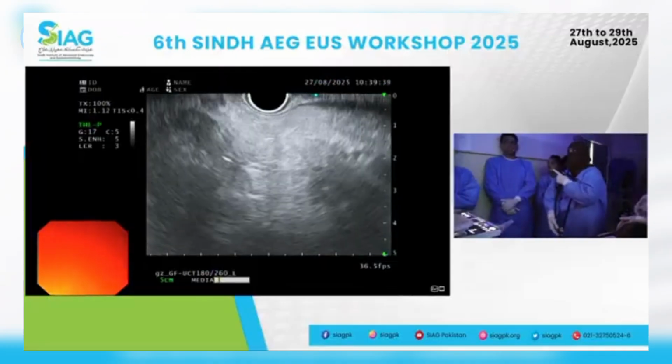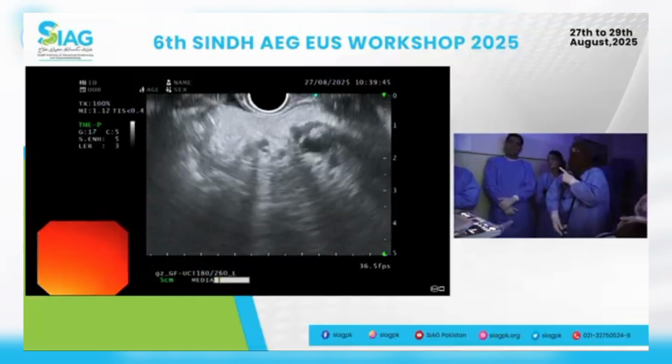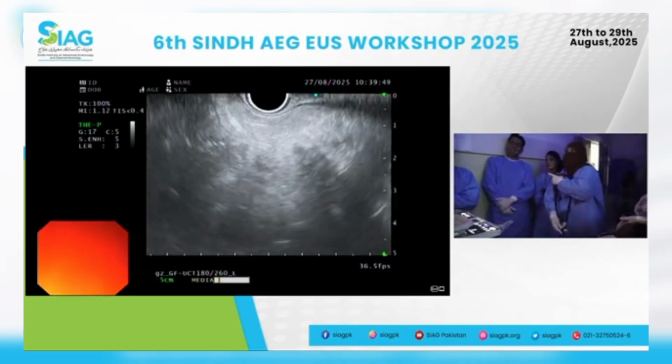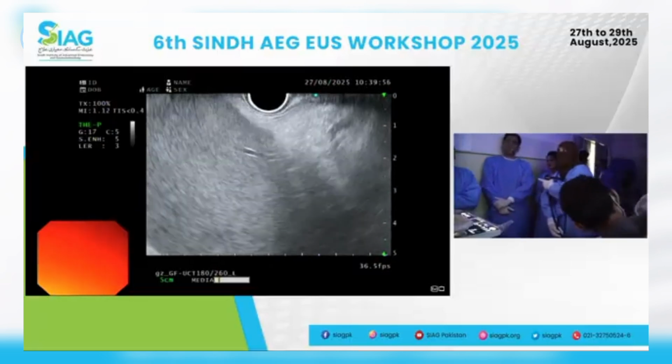Good. If you've seen the spleen, the kidney is literally right next to it. So focus on the spleen. See if you can see, in the splenic hilum, the significantly dilated PD with some multifocal side branch dilatation. Good, excellent. And now the left kidney should be right next to it.